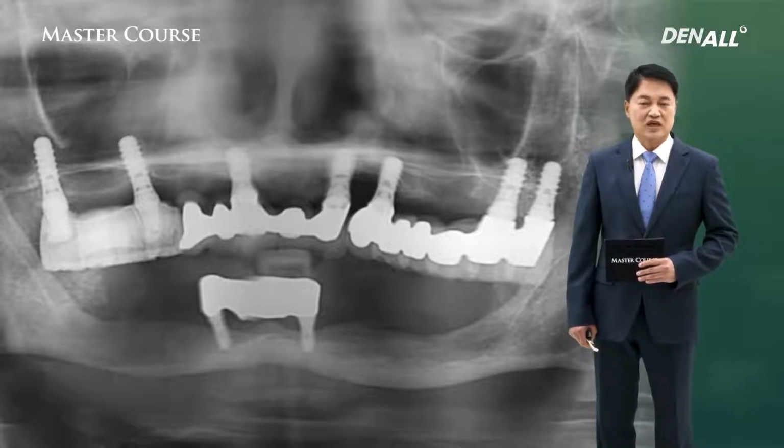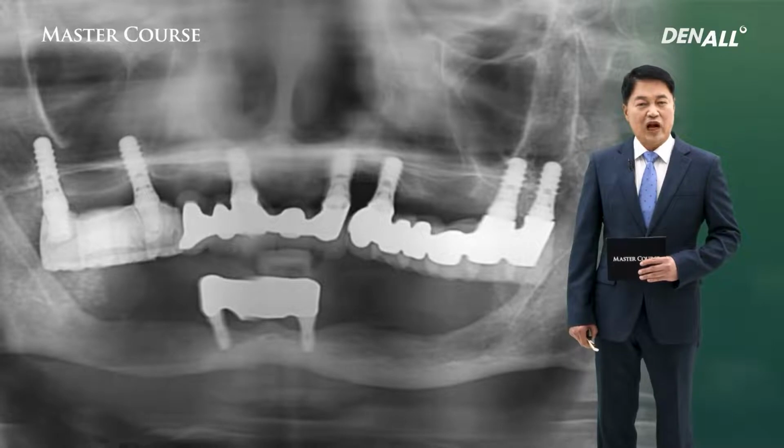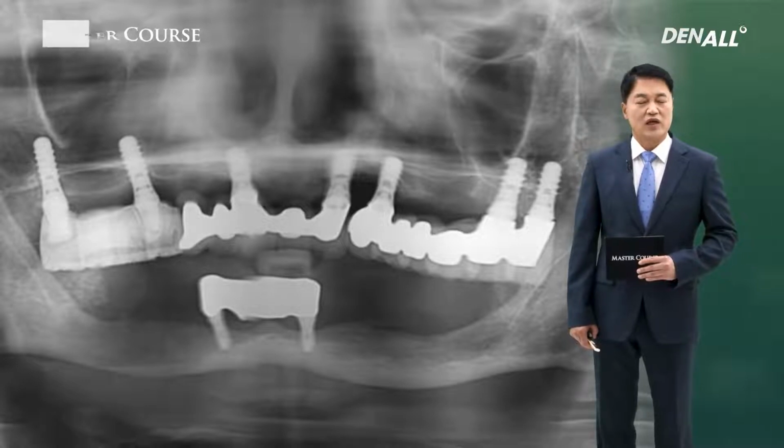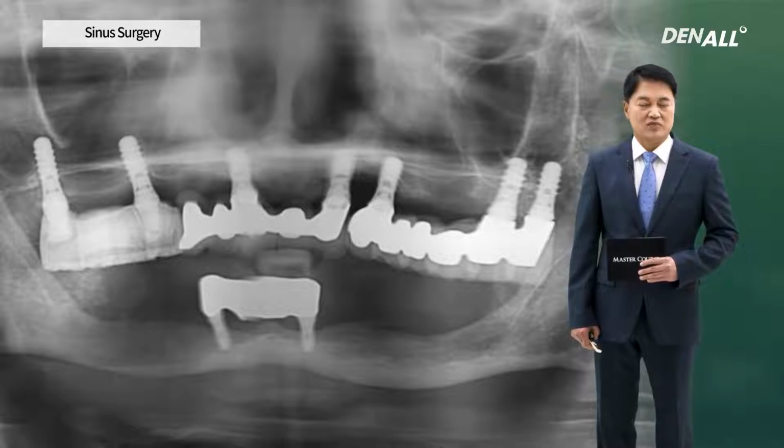So implants not supported by denture, only for those the prosthesis was delivered in the lower posterior. Because there's inferior alveolar nerve, it was difficult to place the implant. So in the anterior, 2 implants were placed and overdenture was done.